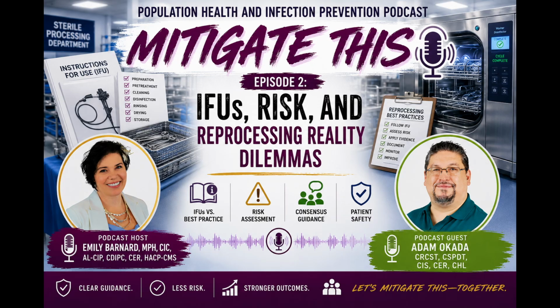I think for sterile processing, individuals or professionals should reach out to IP. IP is a valuable resource and can be a huge ally to sterile processing. I've heard multiple stories in the industry of sterile processing not being able to get borescopes installed in their facility. We should have borescopes on every workstation.